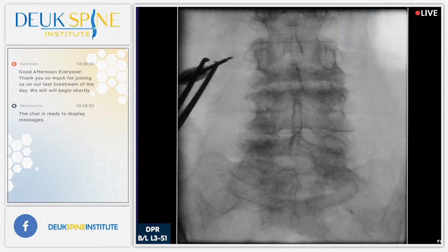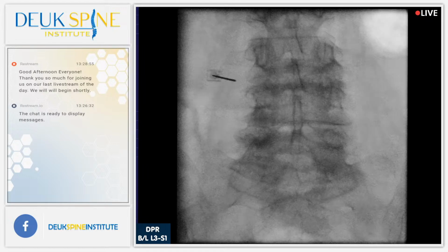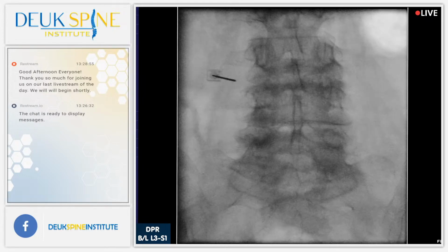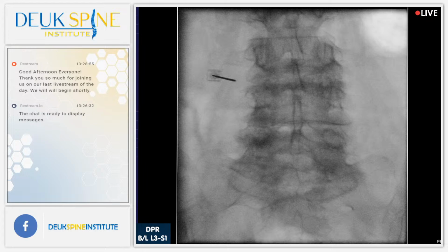You go ahead and position the fluoro. Meanwhile, I'll put the needle in and just get started. Any questions for us as we're doing a Deuk plasma rhizotomy, which is a rhizotomy, but a really souped up rhizotomy. Souped up in the sense that with an RFA, you're using a skinny little probe to do the rhizotomy. Here, I think I see it. It's just below that shelf for the bone spur. We're too high for it right here.